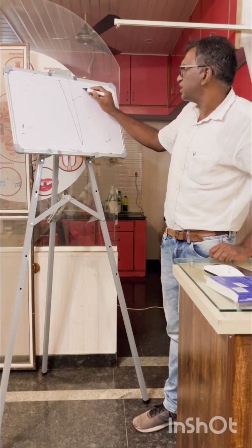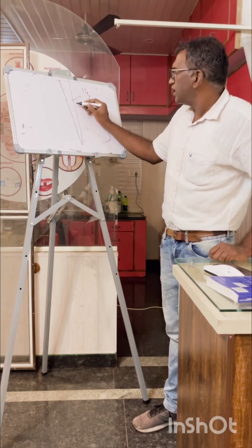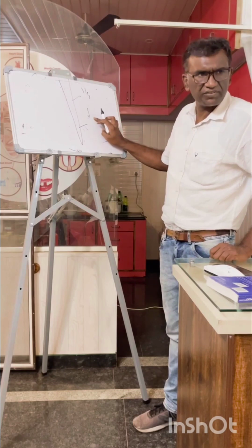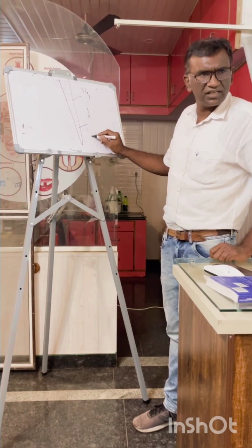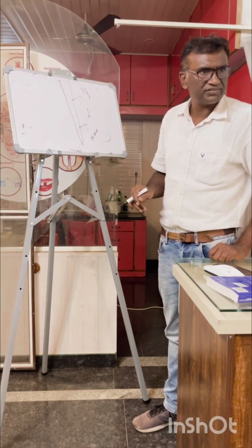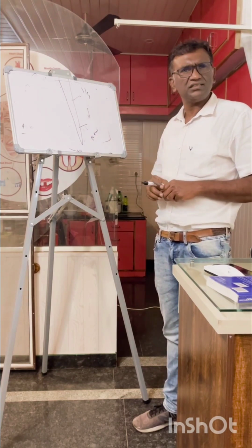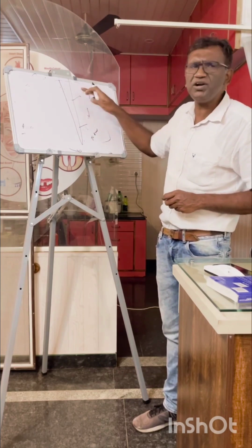In the cervical third it is like a cone, a little bit broader. In the middle one third it is less broad than in the cervical one third. As it approaches the apical side, it is narrow in the apical third. This is taper. This is natural taper. We have to follow it. This is the natural existing taper. We have to follow that taper.